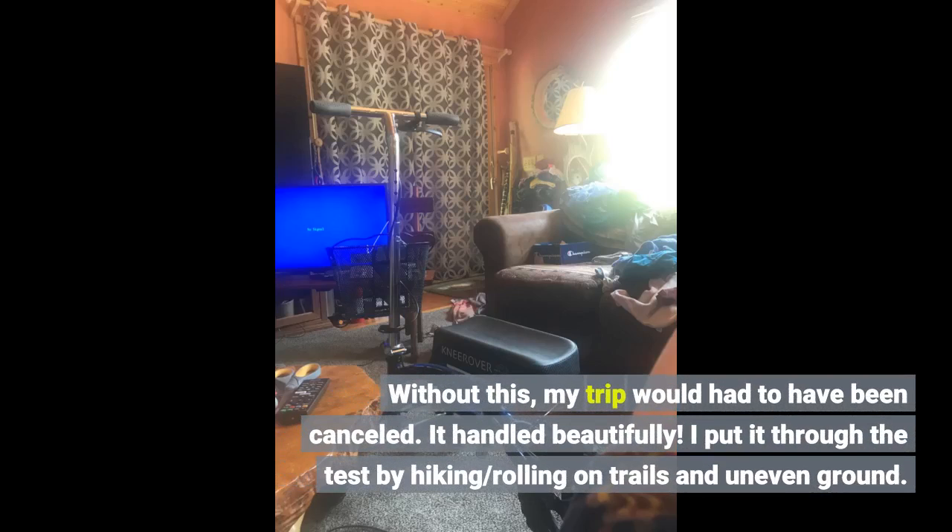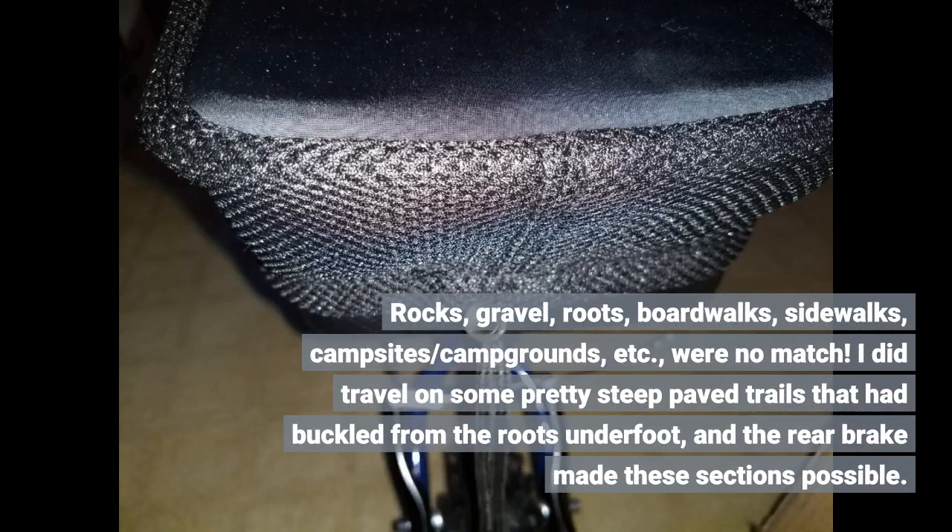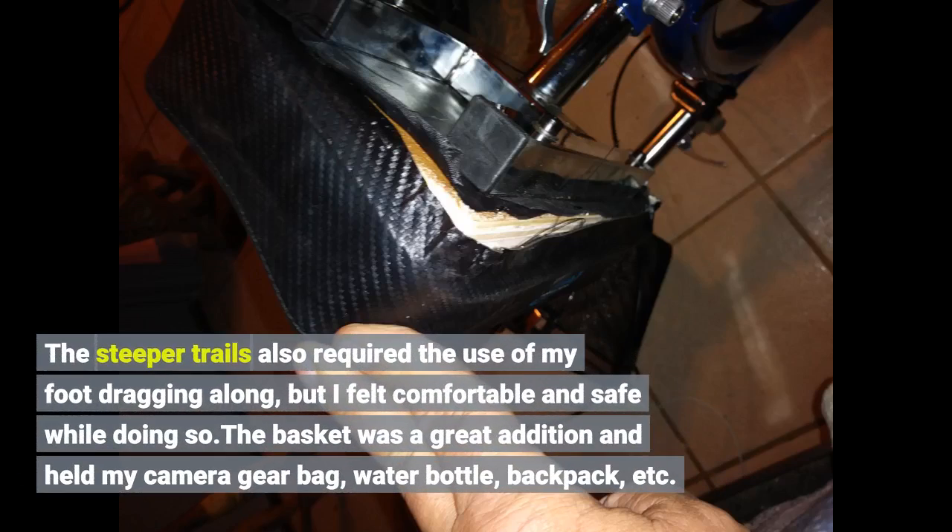Without it, my trip would have had to be cancelled. It handled beautifully. I put it through the test by hiking and rolling on trails and uneven ground — rocks, gravel, roots, boardwalks, sidewalks, campsites, campgrounds — were no match. I did travel on some pretty steep paved trails that had buckled from roots underfoot, and the rear brake made these sections possible. The steeper trails also required foot dragging, but I felt comfortable and safe while doing so.